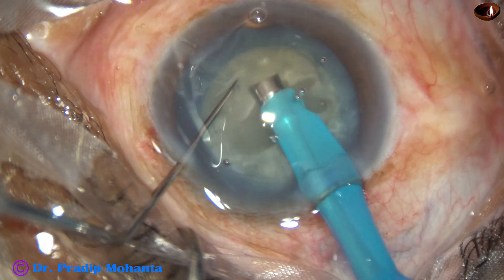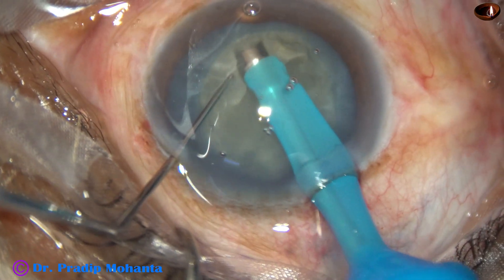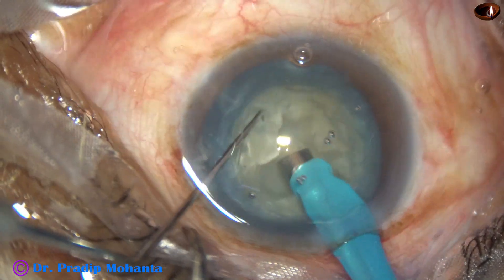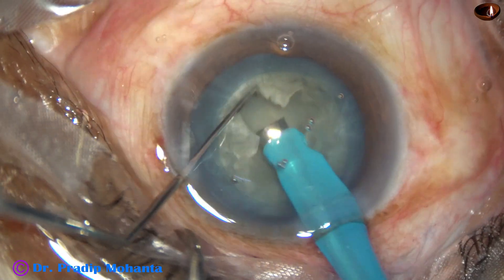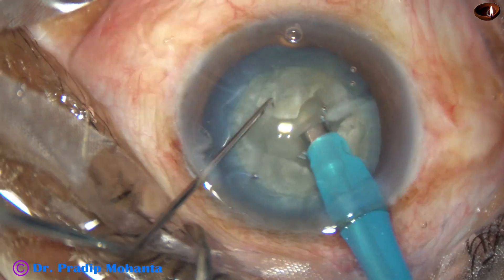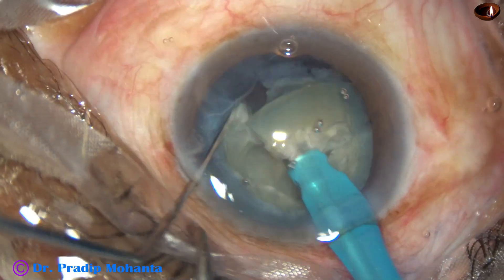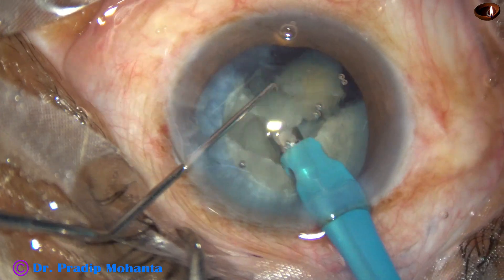After going to a certain depth, when we think that it will crack, we apply opposite forces like this and crack the nucleus. In this case, I held the thick part of the nucleus and chopped it.